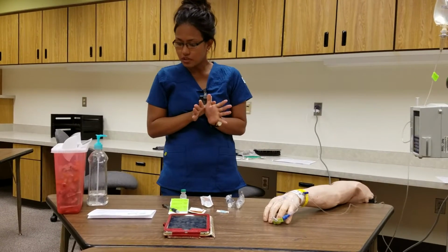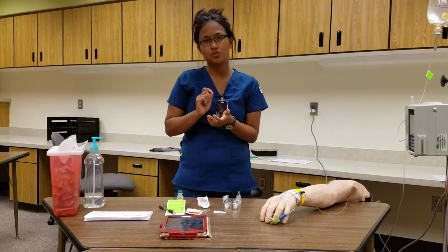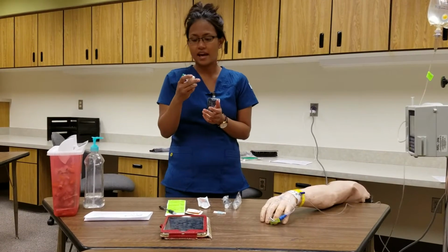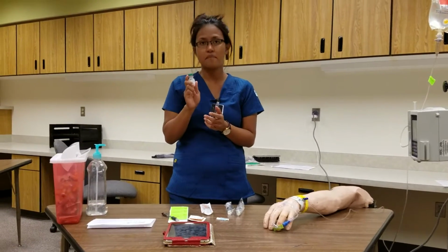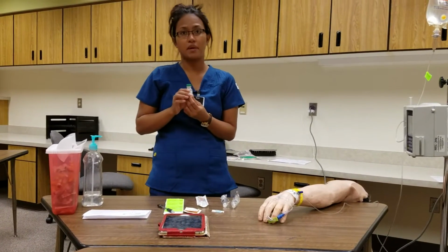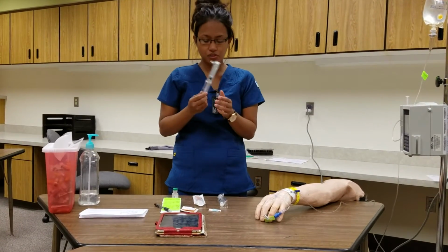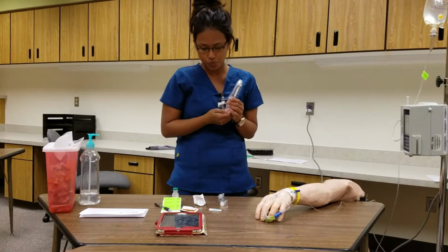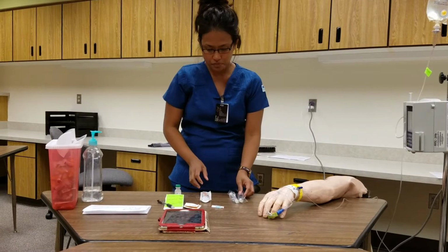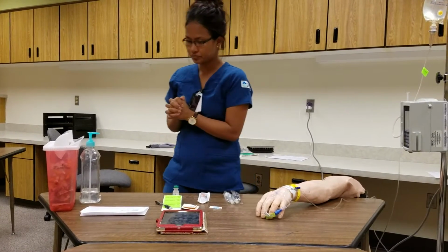After determining that, I will do my dimensional analysis to compute my dosage, and I determined that my vial has 2 milligrams per ml of morphine sulfate. So I will be needing 1 ml for my patient for her pain. I got my 10 ml sodium chloride to mix with, and I also got 3 ml to flush. And now I will be preparing my medication for my patient.